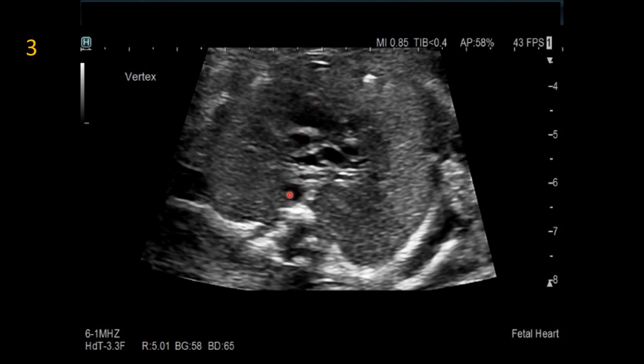We're still seeing the aorta here. We've lost that circle here, but what you should keep in your view is these two circles here. These are bilateral superior vena cavae. And so you'll see that as we go through this study. But interestingly, there is another structure that's shown very well here, and this is the pulmonary artery bifurcation. And so as you see, there's not a main pulmonary artery in this picture, and we'll see why that is coming up.